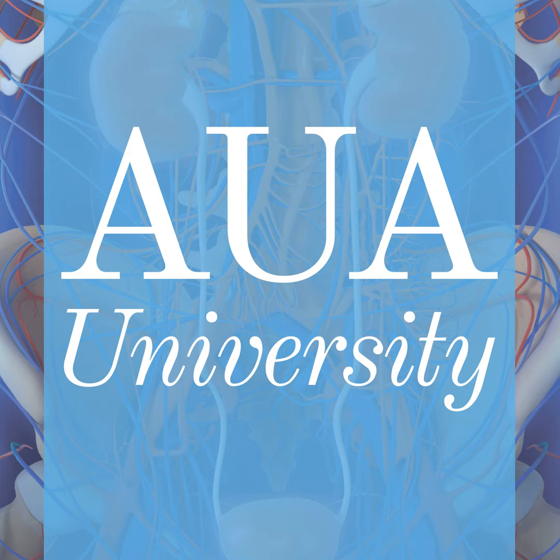So this was also a study that looked at the predictive value of PSMA in men with biochemical recurrence undergoing salvage radiation. You can see here, this was a study from Australia, which has been ahead of the curve when it comes to utilizing PSMA PET scans in the monitoring and actually initial evaluation of their patients. You can see the inclusion criteria, median follow-up. And you can see here the sites of recurrence that were found on PET scan, including negative scans, fossa, pelvic nodes, distant nodes, and bone metastasis, and visceral metastasis, which obviously we did not see a lot of when we used conventional CT and bone scans.